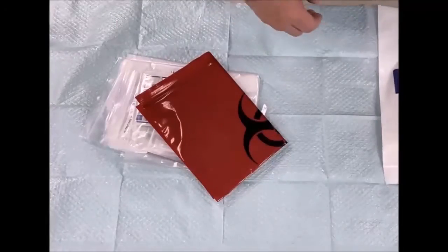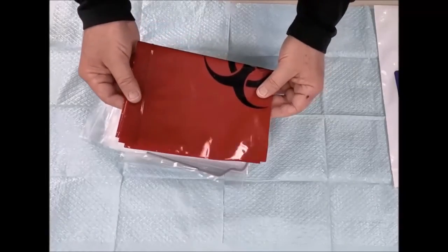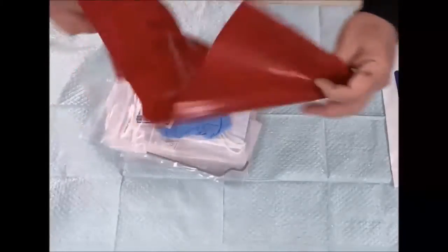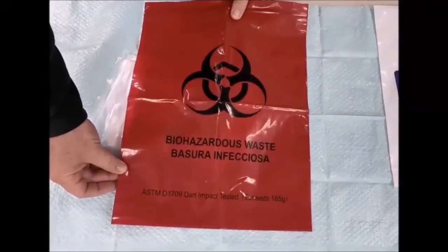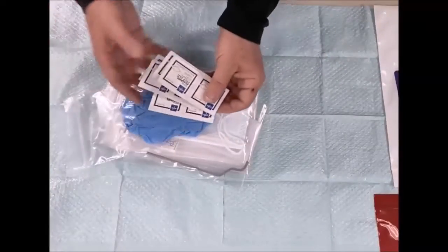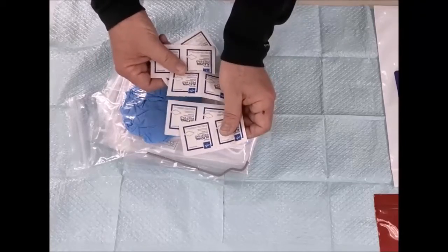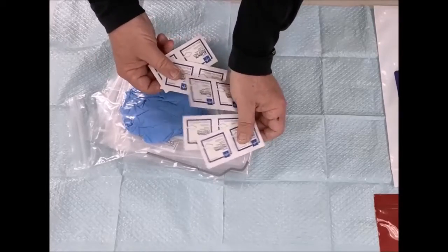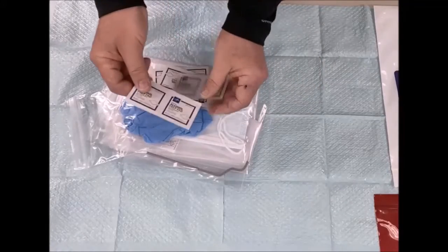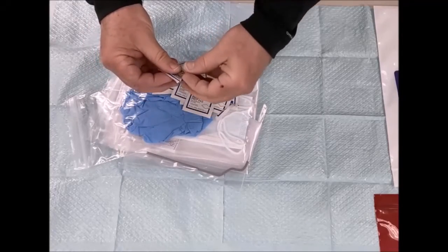It is Eyebrite. So basically you have the biohazard waste bag, and you have some alcohol pre-loaded in little pads. It's pretty cool, very interesting. And you have a good amount of them here.